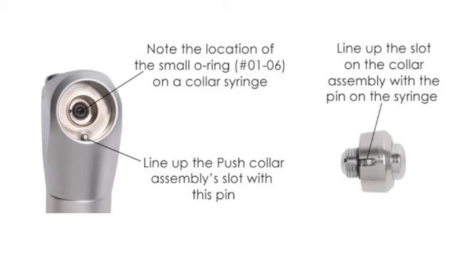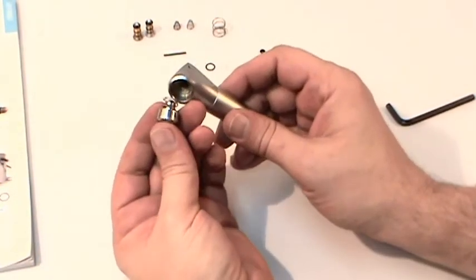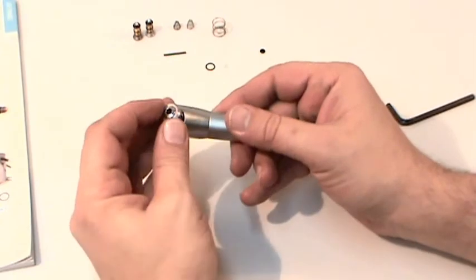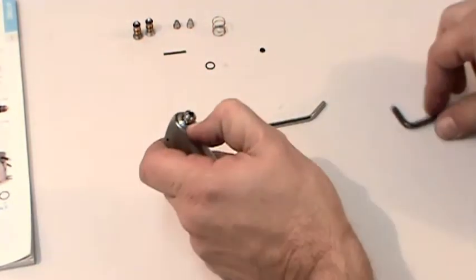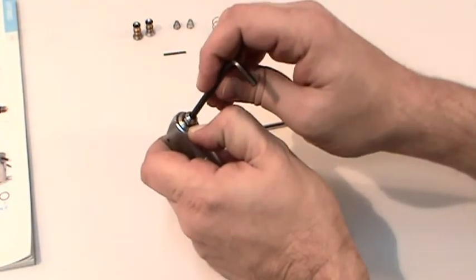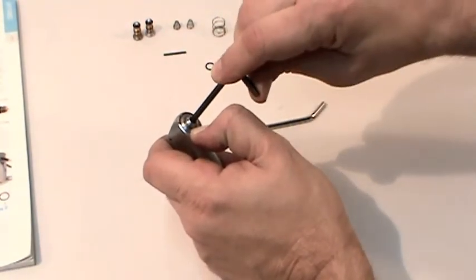Note the notch in the collar on some collar syringes. Make certain that this notch is lined up with the pin at the bottom of the hole where the collar assembly will screw. You'll want to depress the collar fully before tightening to make certain it is properly aligned. If the notch is not aligned with the pin, you won't be able to depress the collar.